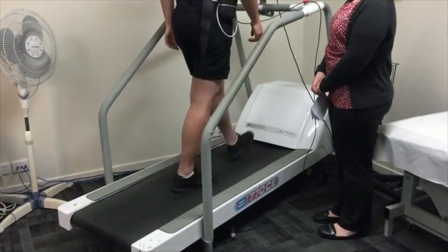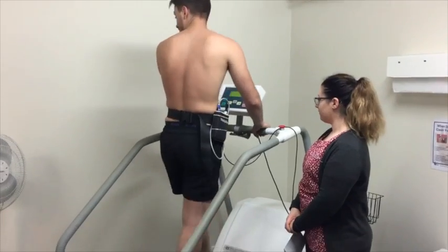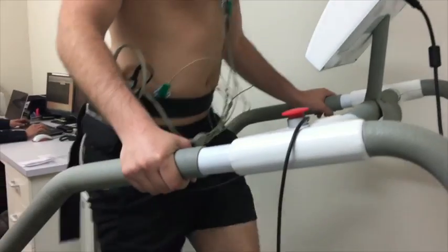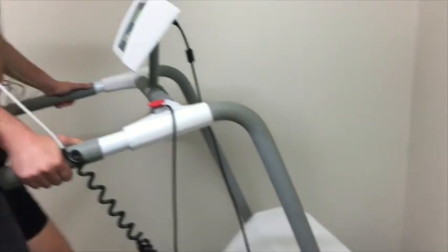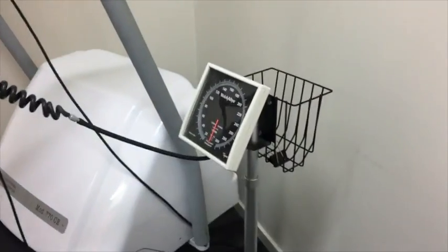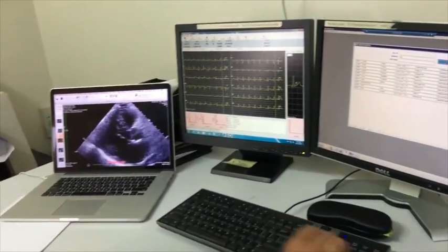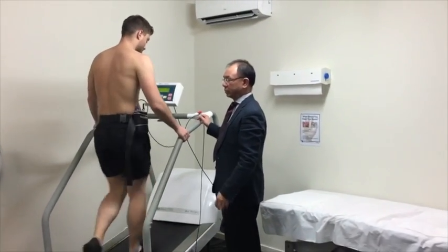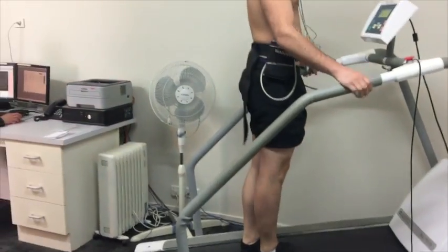In most heart west centers, treadmills are used for exercise, starting at very slow speeds but getting faster and higher every few minutes. The idea is to get your heart rate up to its maximum rate. Your blood pressure will be measured a few times during the test, while your ECG will be monitored throughout the procedure.